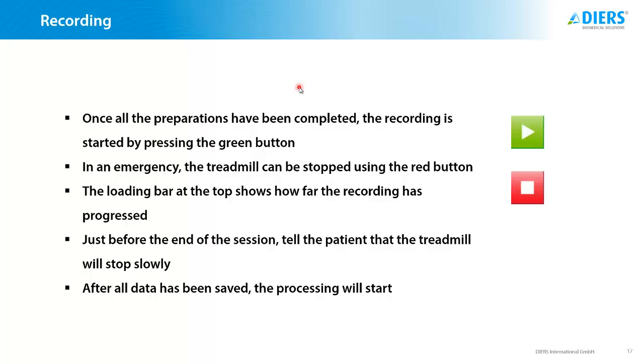I don't do that myself because once the 5 seconds are finished, the system will slowly slow down in small steps and will stop completely. So it's not like the system will stop immediately. The patient will definitely feel that the system is slowing down. And after all data has been saved, the processing will start.